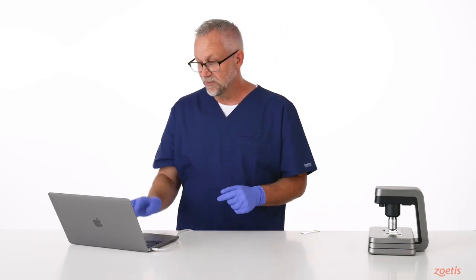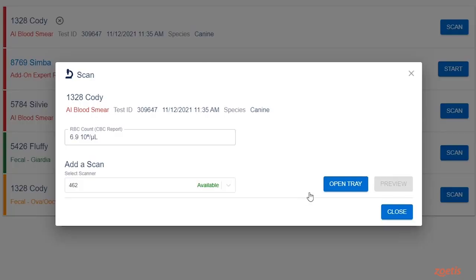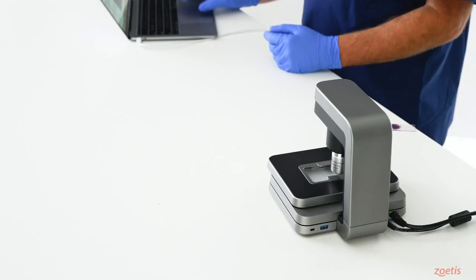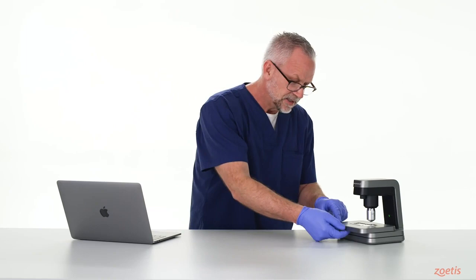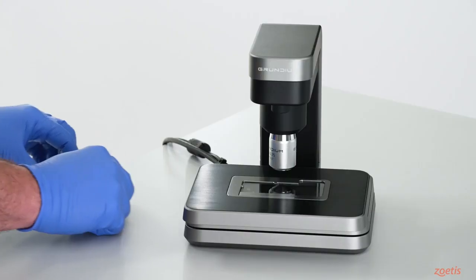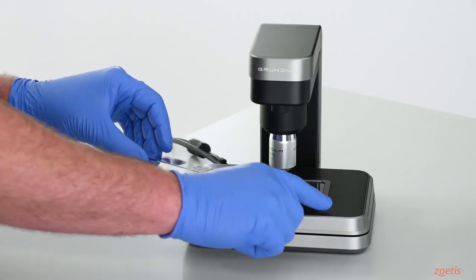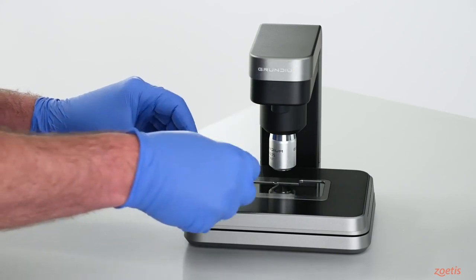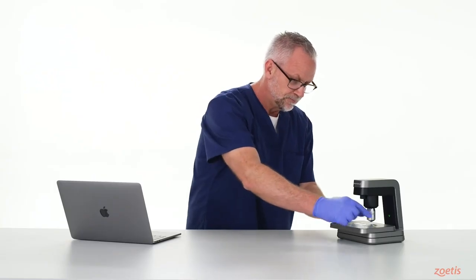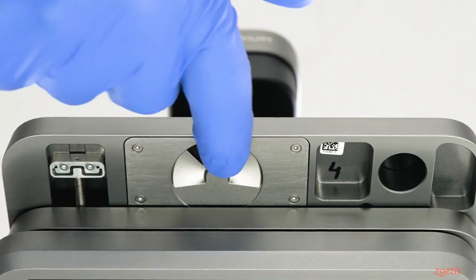If it's closed, you can return to VetScan Imagist and click on the Open Tray button. With the locking mechanism open, place the slide with the label towards the right side of the stage and facing up, and then close the locking mechanism.